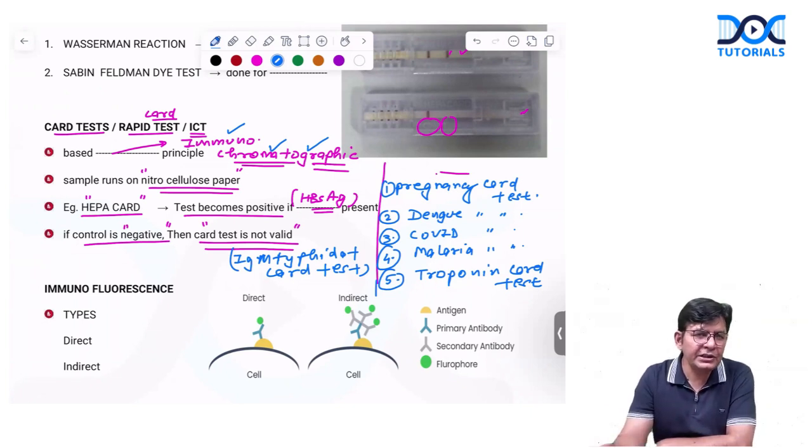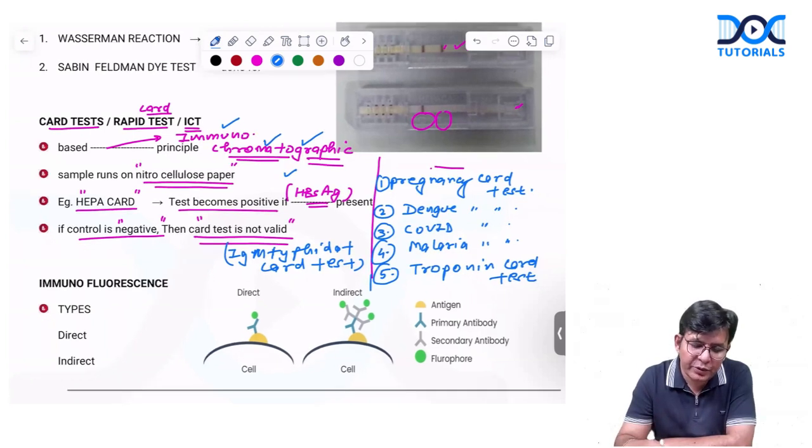Most of the reactions that happen in antigen antibody interaction mostly happen in the zone of equivalence. Two main reactions are there, precipitation and agglutination. In precipitation, the typical example is flocculation, which is being used nowadays, that is VDRL or RPR. Other than that, you have the agglutination one. And in the agglutination one, what we have? In the agglutination one, we have insoluble antigens mixed with antibody to produce what? Clumps, and clumps are visualized properly.